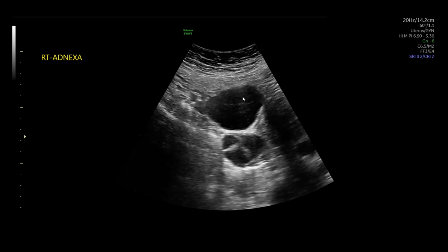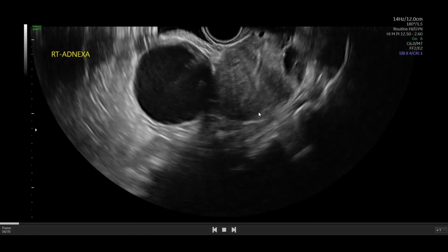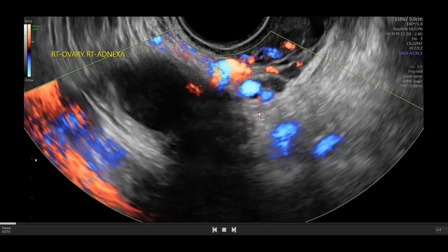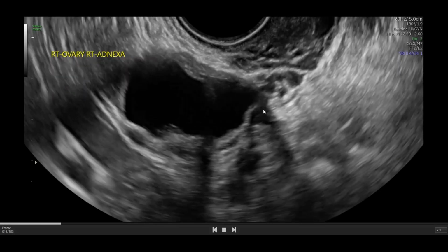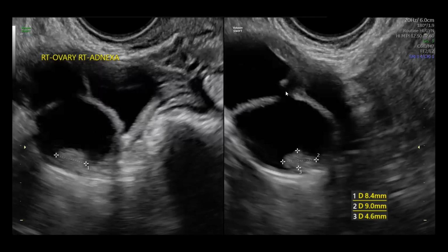So we'll leave you with this last image here. This is the TA view. Actually, let's come back to this as I sum up some stuff. We'll let this be the last image before I end this episode.